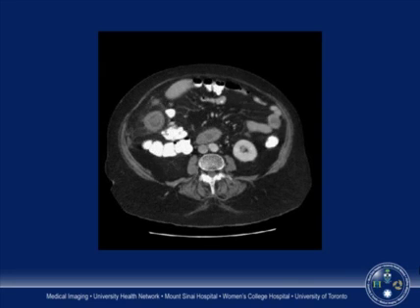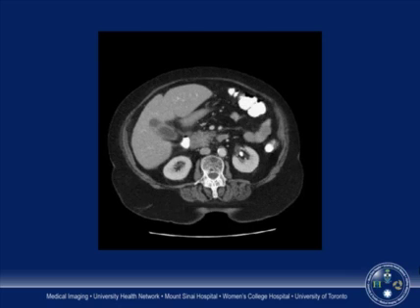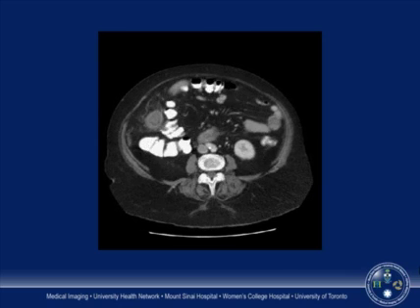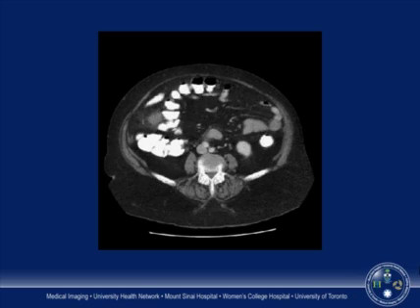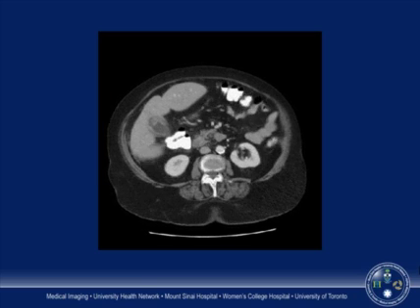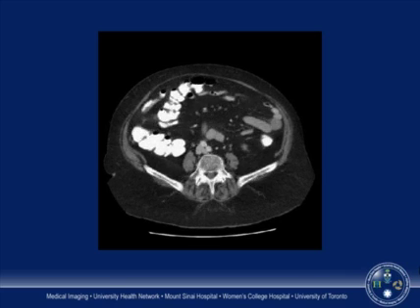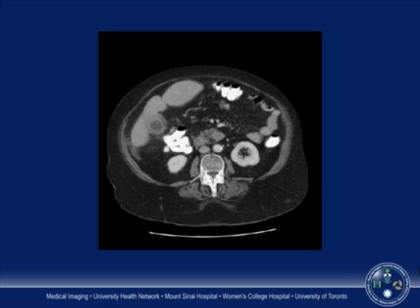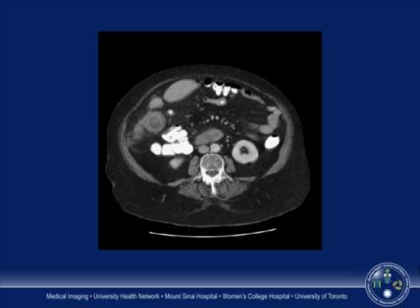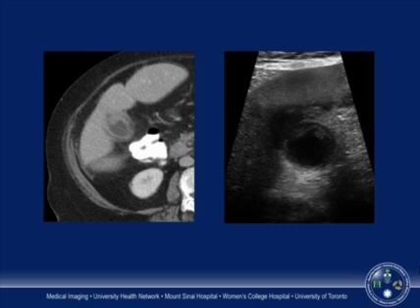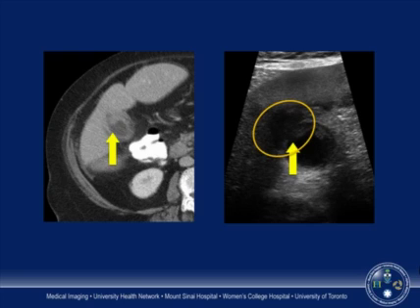In another case, CT was performed to rule out bowel obstruction in a patient with vague abdominal pain. A fellow suggested acute cholecystitis, but the gallbladder was not tensely distended. Looking more closely at the gallbladder fossa, we identified a second cystic collection — the gallbladder had perforated, decompressed, and was therefore not tensely distended. A pericholecystic abscess had formed, illustrating the importance of the teaching pearl: be reluctant to diagnose cholecystitis without tense distension.